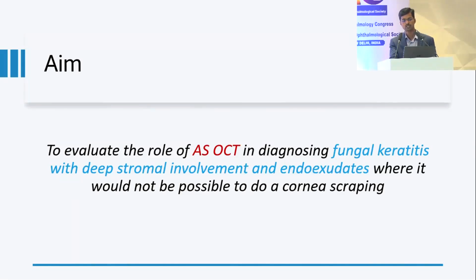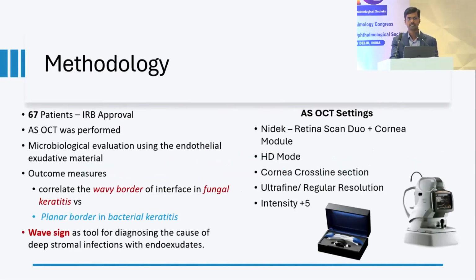The aim of the study is to evaluate the role of anterior segment OCT in diagnosing deep-seated fungal keratitis with endoexudates with intact corneal epithelium. Methodology.